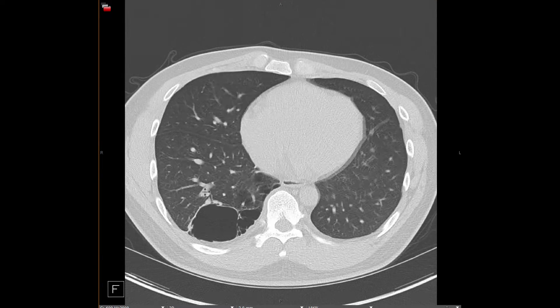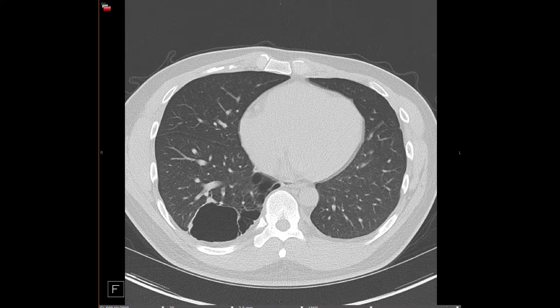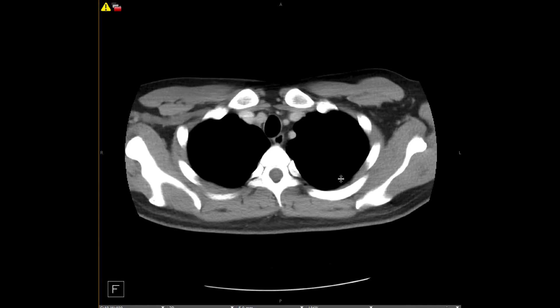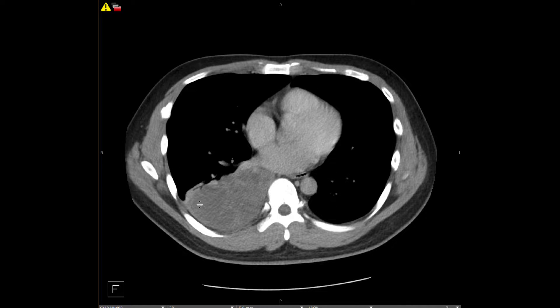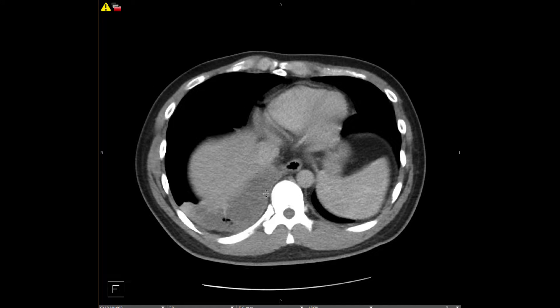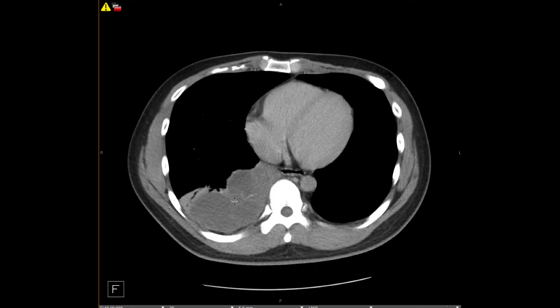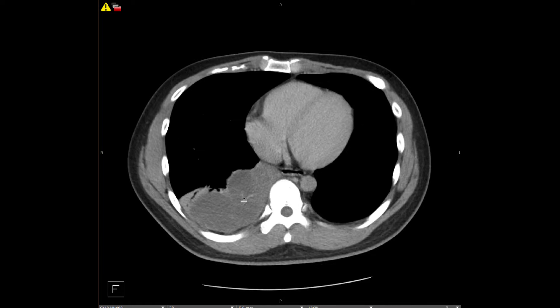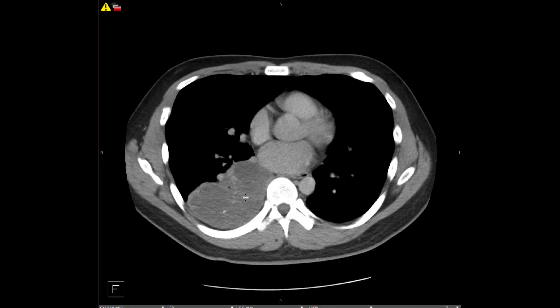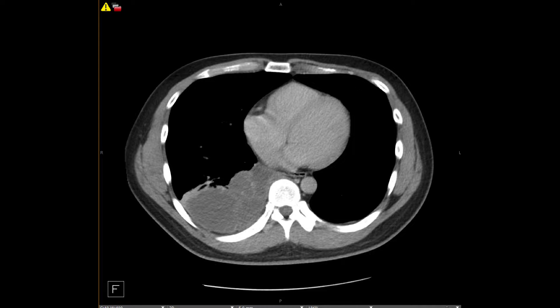You can see here a large area of cystic change in the right lower lobe. The way this patient initially presented, this lesion was fluid-filled and simulated a tumor. All of the internal attenuation was fluid and it seemed like there were vessels passing through it, so we suspected this was some kind of congenital abnormality and we performed an MRI.